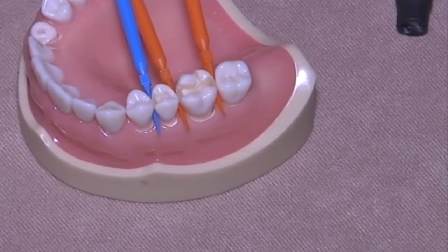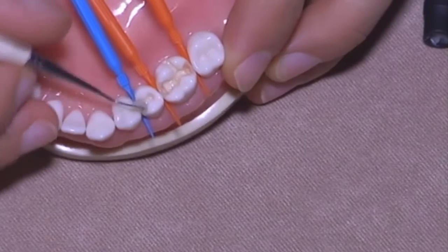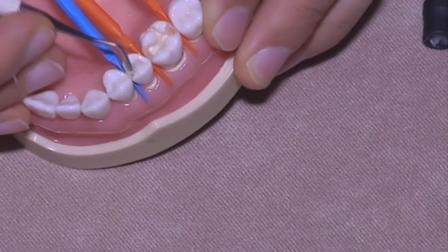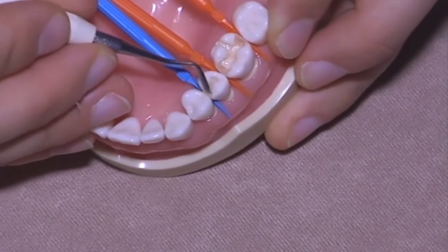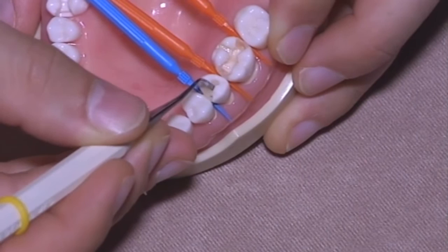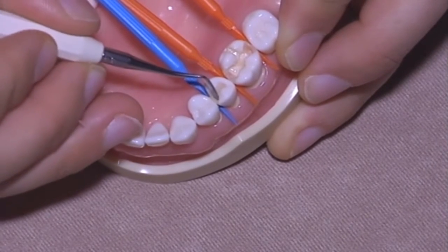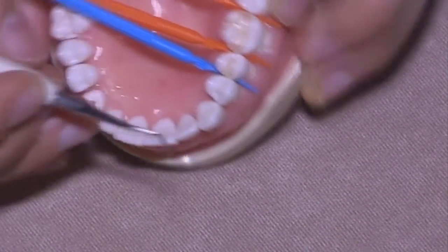So let's come back to the second premolar, and let's start layering with an oblique technique. So you just have to push, and I used to take care first of one side and secondly of the other side. So first I shape the palatal side of the cavity, and then I will shape the vestibular side.